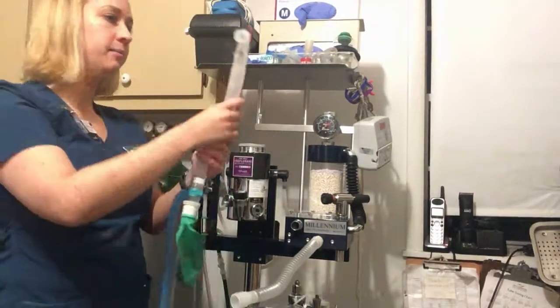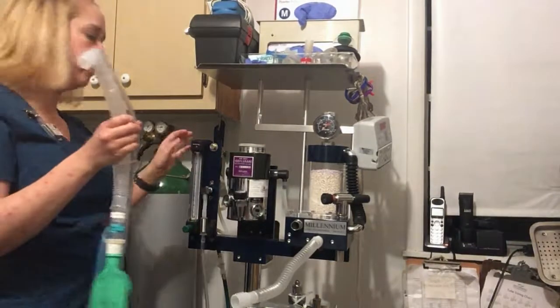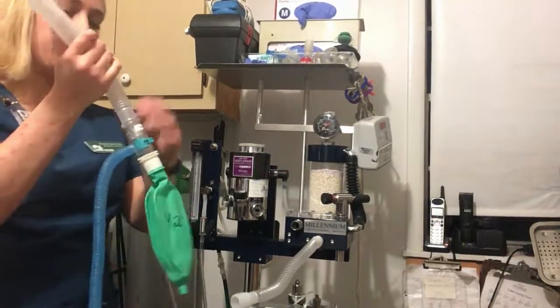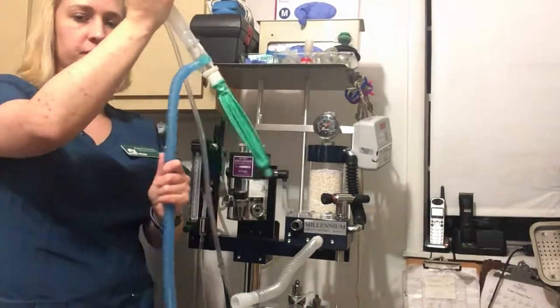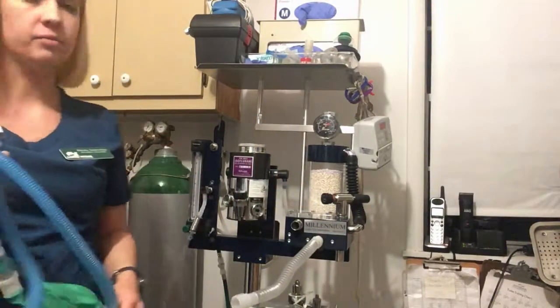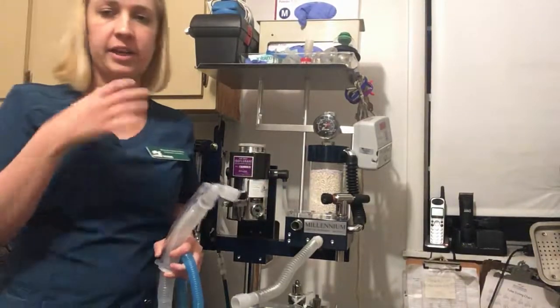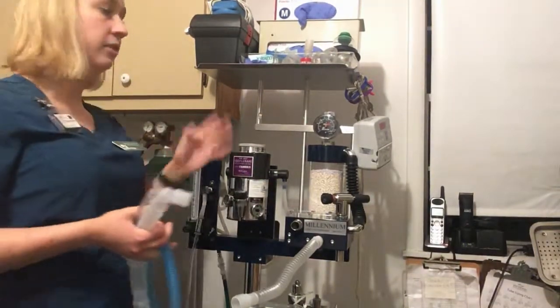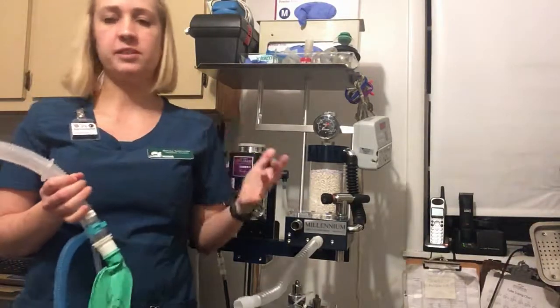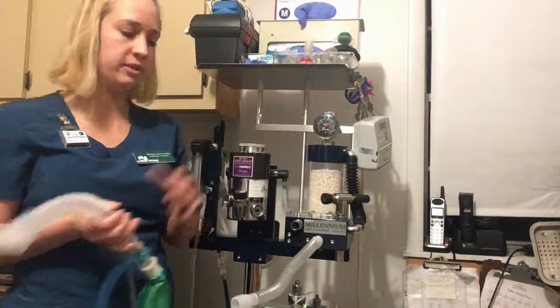So with this one, through this tube they'll inhale the fresh oxygen and isoflurane. And when they exhale, it will be sent directly through the scavenging system to scavenge out all those exhaled gases. So they're not going to be inhaling any of their own exhaled gases as you would with the rebreathing circuit. Like I said, the smaller patients don't have as much pressure and airflow going through the system.